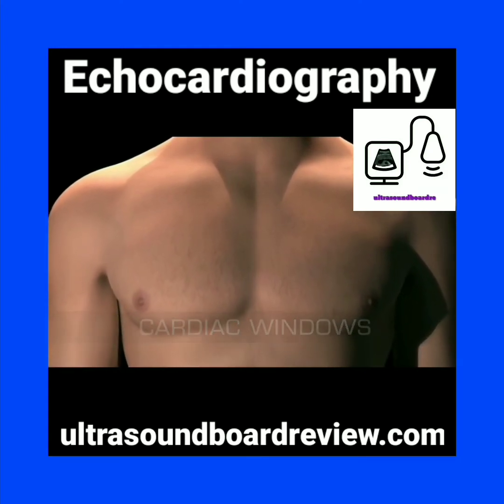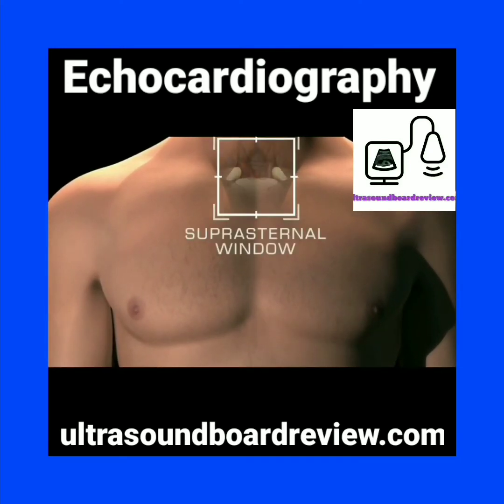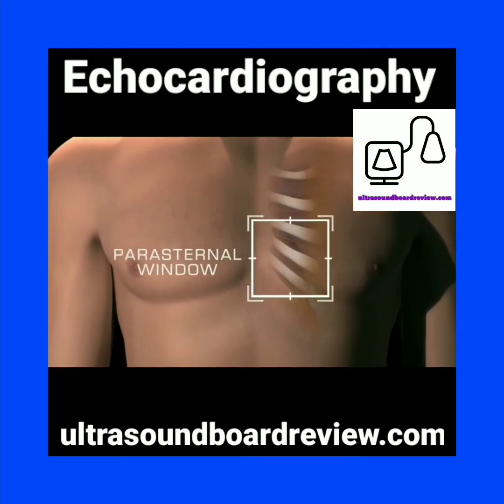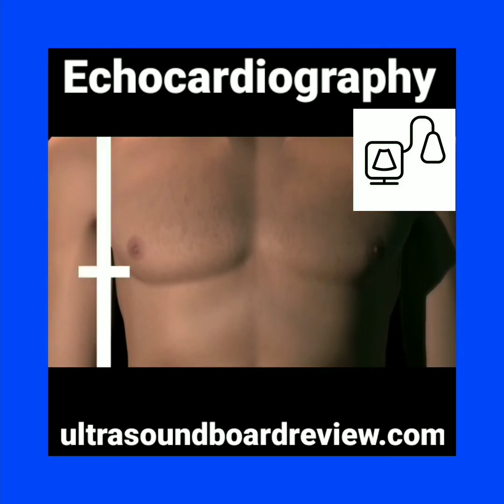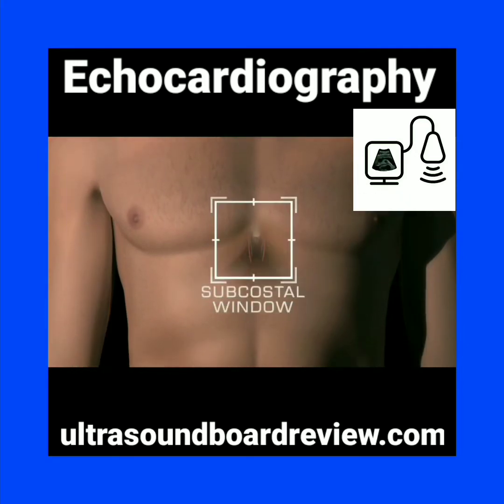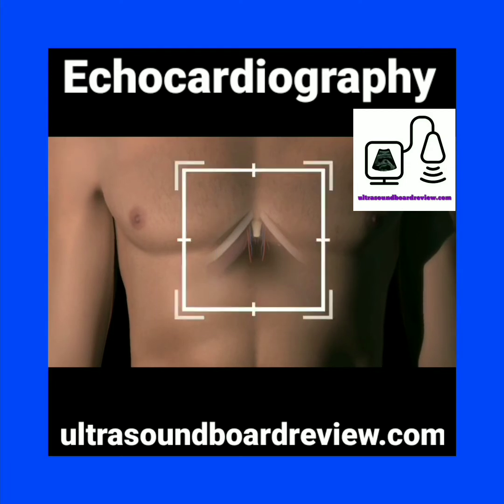These windows include, but are not limited to, the suprasternal, parasternal, apical, and subcostal windows.